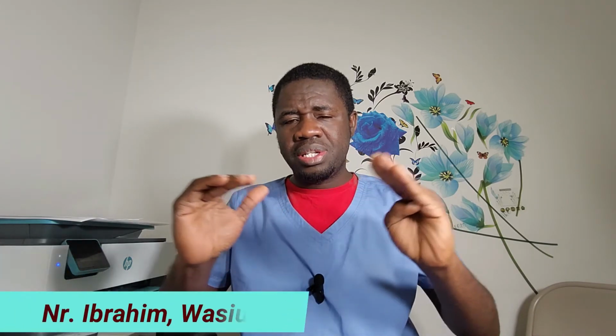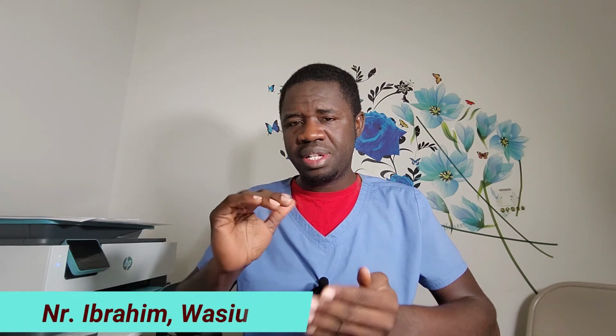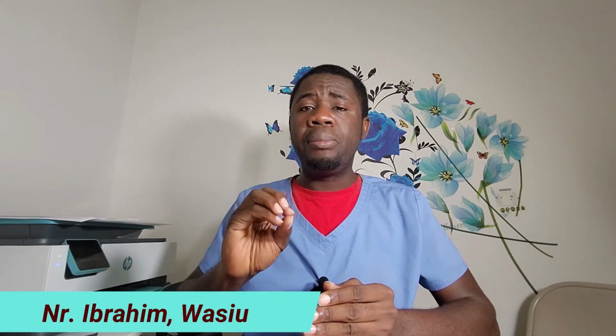Now, there are boxes in an EKG graph that correspond to 0.12 and 0.20. So in this reading, the PR interval is slightly above the normal.